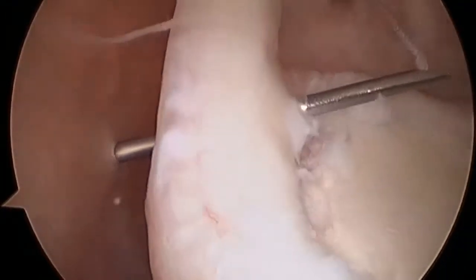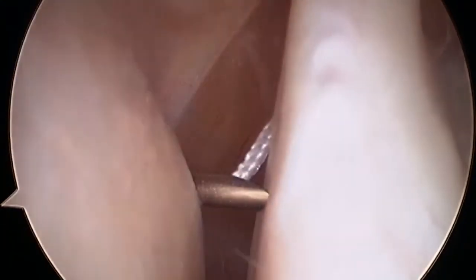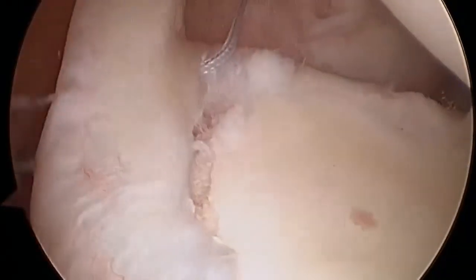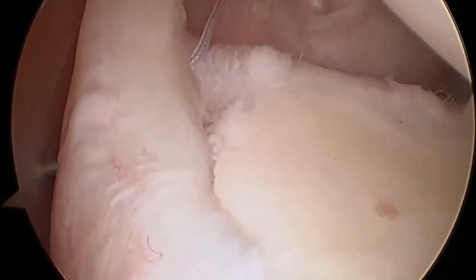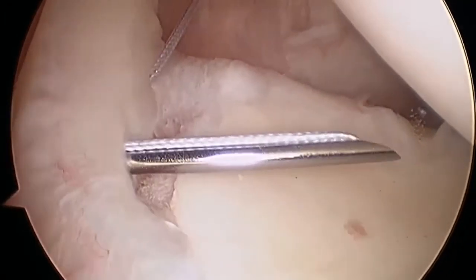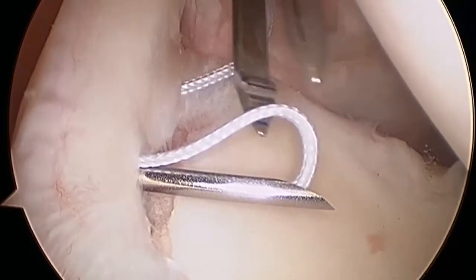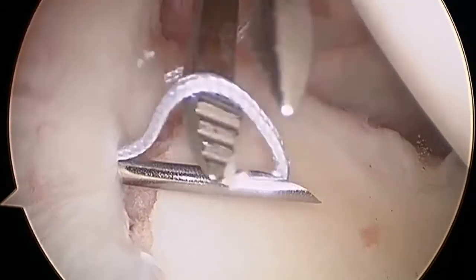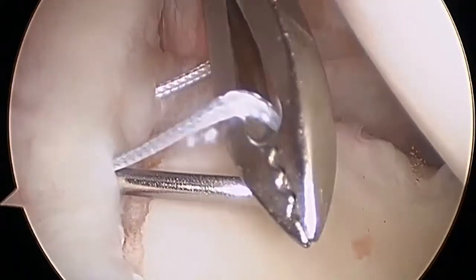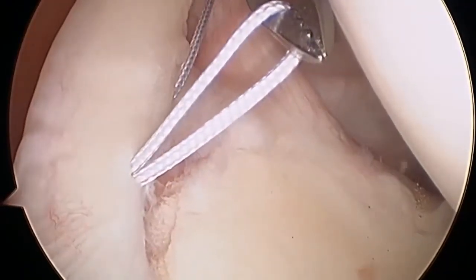The spinal needle is then carefully withdrawn to lie behind the biceps. The tip is then repositioned slightly posteriorly and passed through again to create a mattress suture. If the needle is then withdrawn very slightly, a suture loop is created, making retrieval from the anterior portal easier.